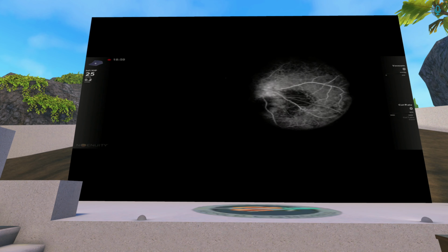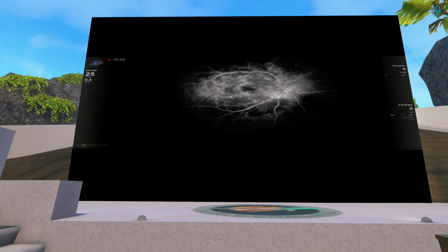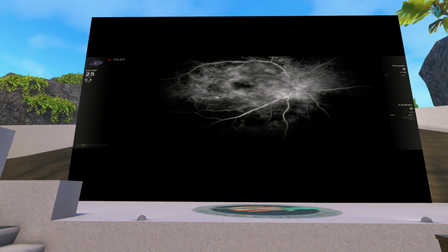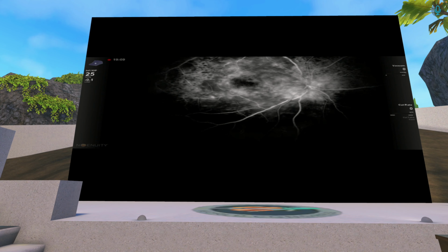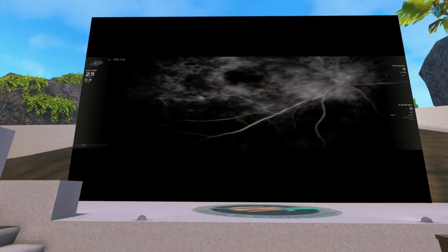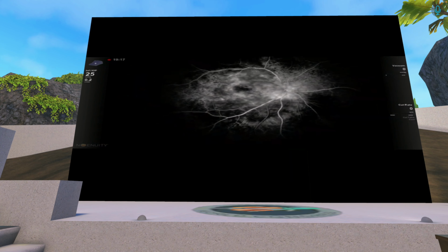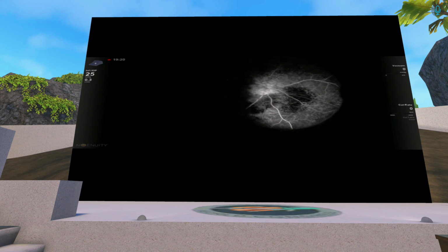Do you have a sense that one light source is better than another one? I mean, we've modified the constellation, but I don't know whether there's another light source that may have a better optimization for an exciter filter.